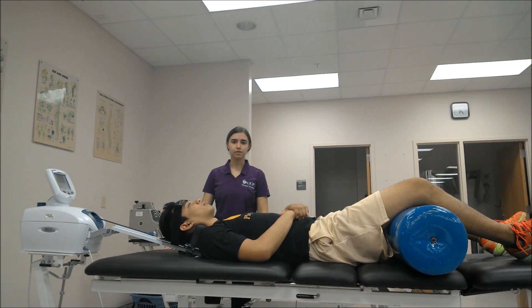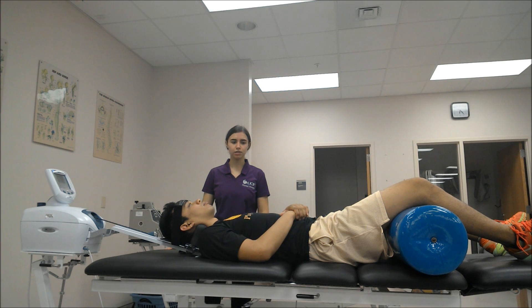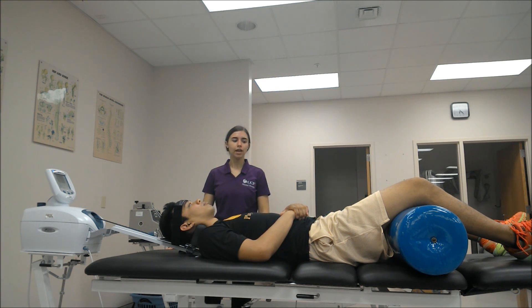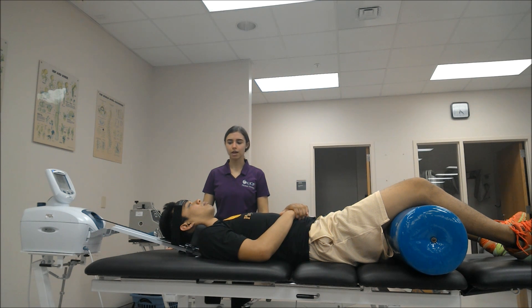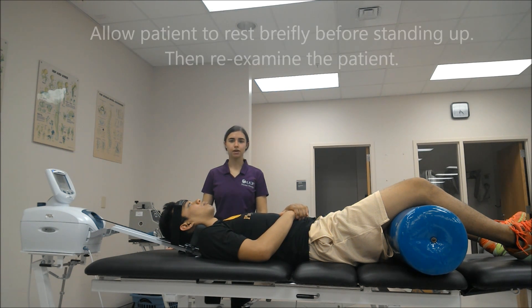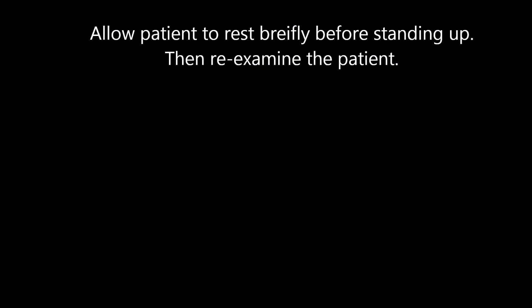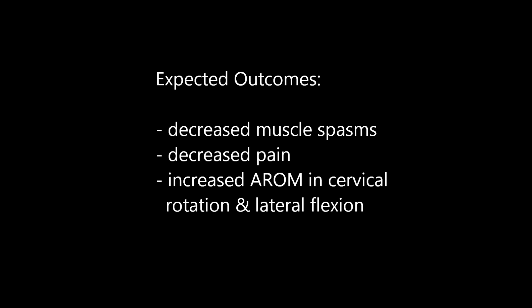In future treatments, you may need to adjust the parameters slightly — you may need to increase the force of traction, and you might be able to increase the time of traction, depending on the patient's response. Expected outcomes include decreased muscle spasms of the paraspinals, decreased pain, and increased active range of motion in cervical rotation and lateral flexion.